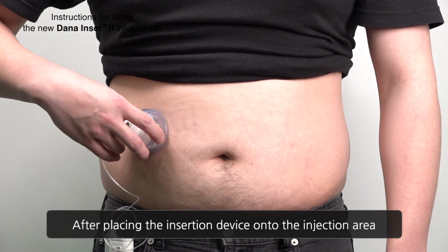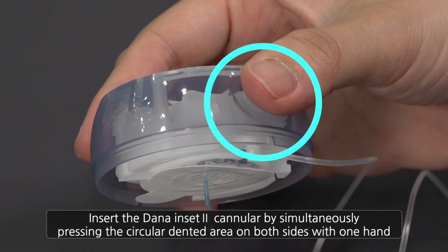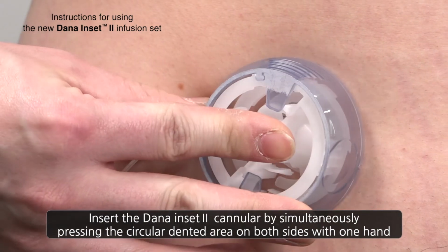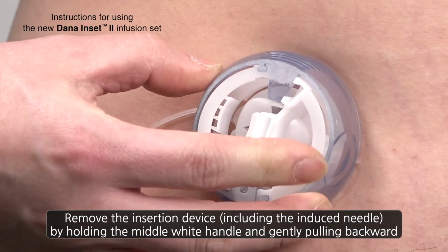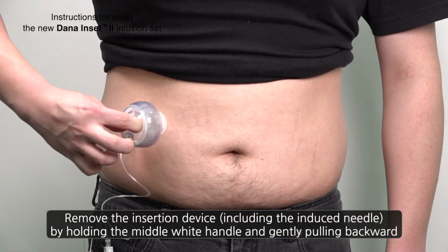After placing the insertion device onto the injection area, insert the Dana Inset II cannula by simultaneously pressing the circular dented area on each side. After the deployment, gently push the center of the insertion device to ensure good adhesion with skin. Remove the insertion device, including the introducer needle, by holding the middle white handle and gently pulling away from the body.